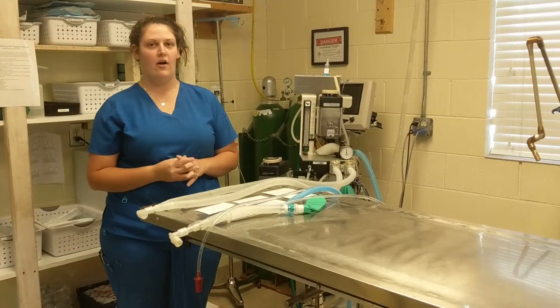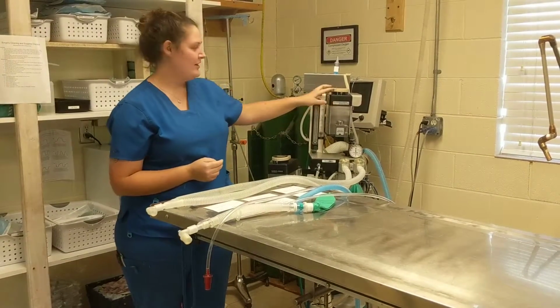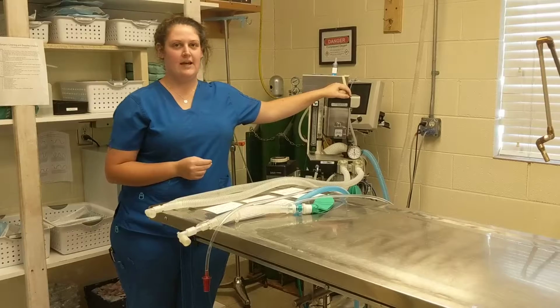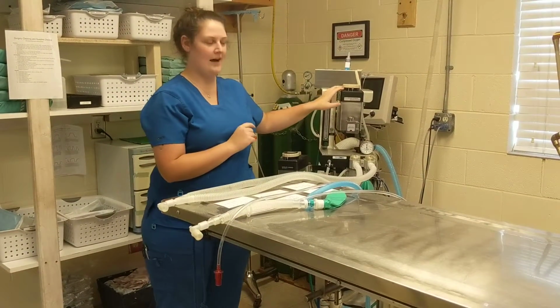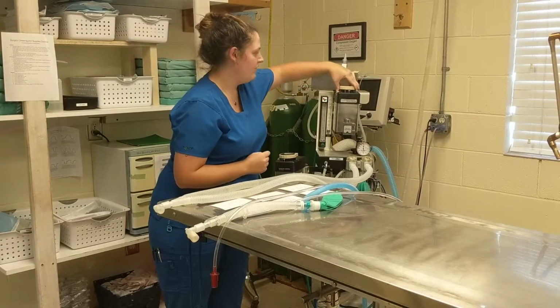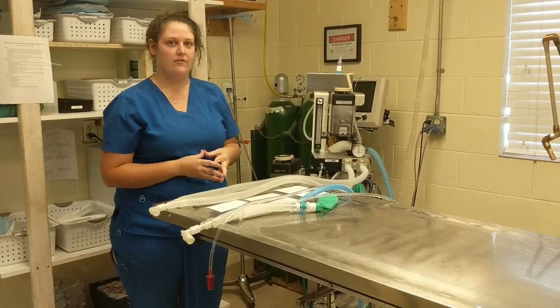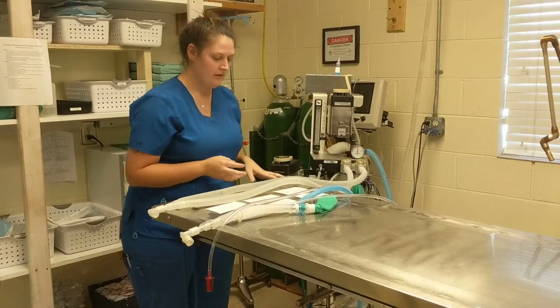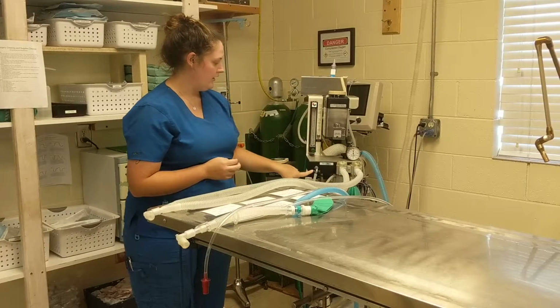Now that we've done our oxygen, we get to see our maintenance drugs at work. Our maintenance drugs are controlled through this attachment called a vaporizer, and the vaporizer is controlled through this dial. It goes from 0 to 5%, and 5% is the maximum dose allowed for the isoflurane for our patients. Once the drug and the iso are mixed, we see it go through this port.